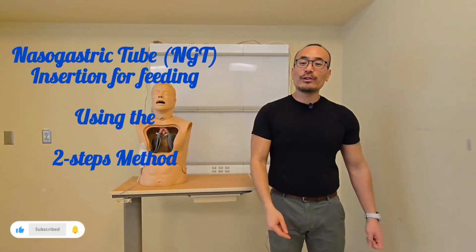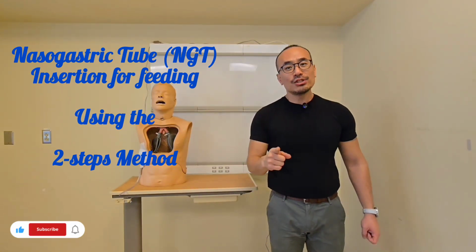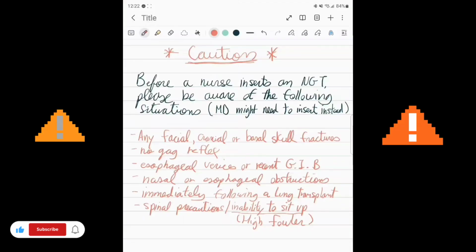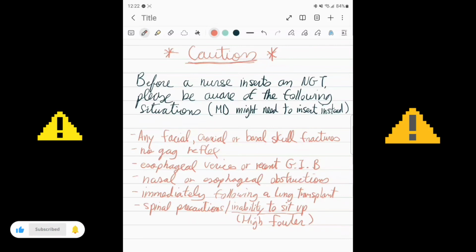In today's video, we're going to demonstrate how to insert an NG tube for feeding and the two-step methods. Before we start inserting the nasogastric tubes or NG tubes, we have to make sure that we are cautious about some of the following situations that might require the doctor or a specialist to insert these tubes.